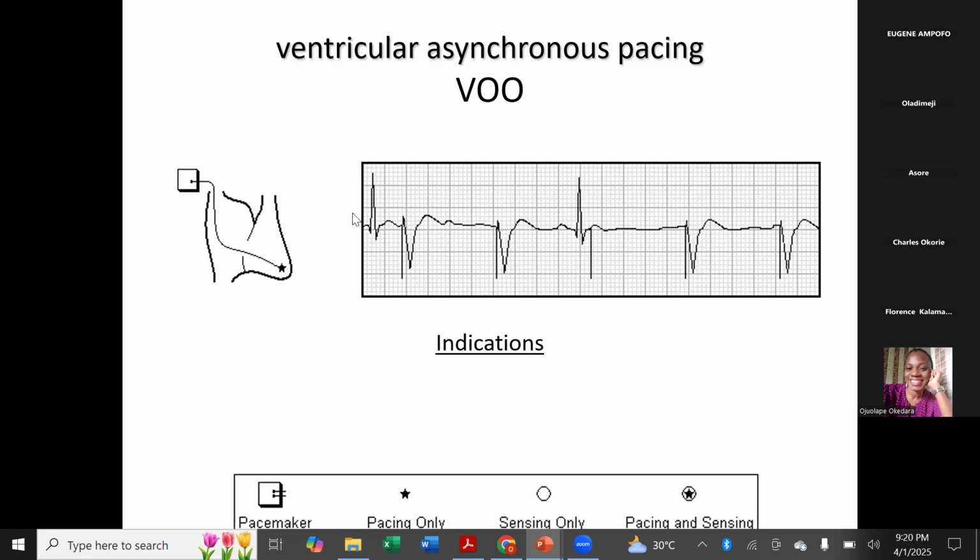Number two is that we can see intrinsic activity of the patient, and shortly after that, you're seeing a pacemaker spike. Because if the pacemaker actually senses this intrinsic activity, then it should withhold pacing and wait for the next cycle, which should be like 4 boxes from the intrinsic activity before it generates the next pacemaker spike. But between this paced QRS and this pacemaker spike, it's like 200 and something beats. Do we expect a pacemaker to be giving us a rate of 200 and something beats? No, it should not be programmed that way, right? So that means it did not recognize this intrinsic activity.